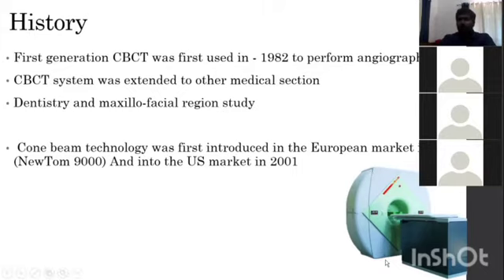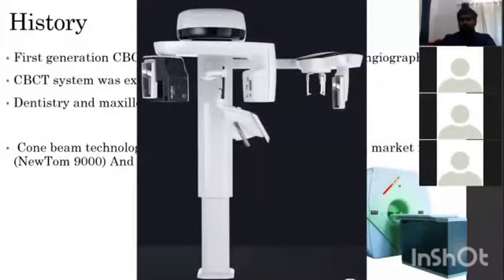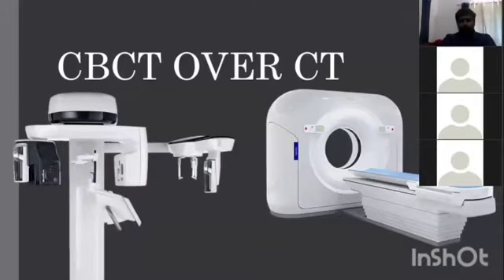And as a PSM staff, the whole PSM family was proud to have the same branded machine, the Newton Giano XR. This is that machine in our Department of Oral Medicine and Radiology.